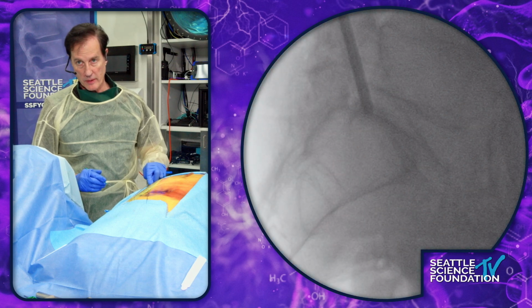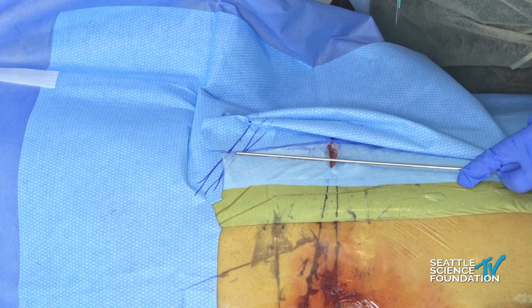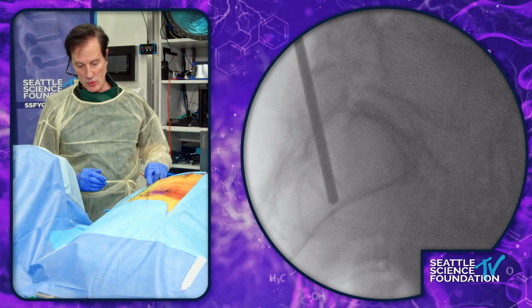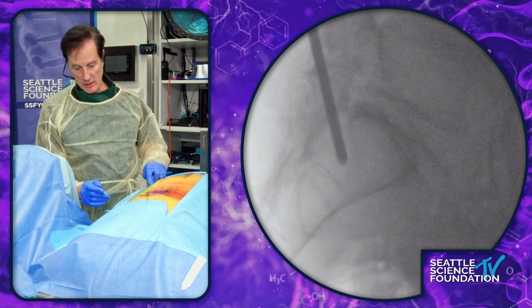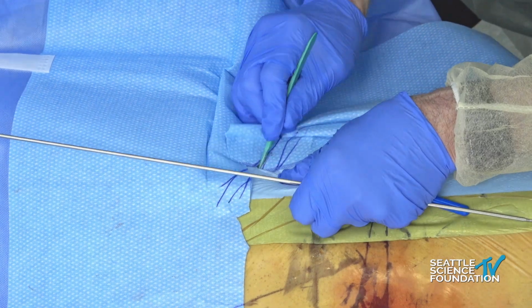Good. Picture. I'm going to go picture in the mid body of S1, picture. And we're going to make an incision right about there. This will be our starting point.